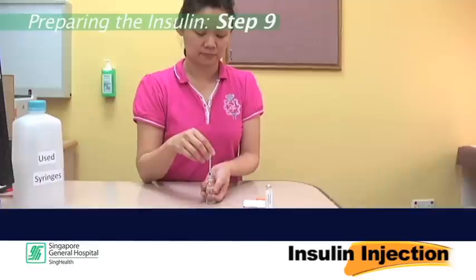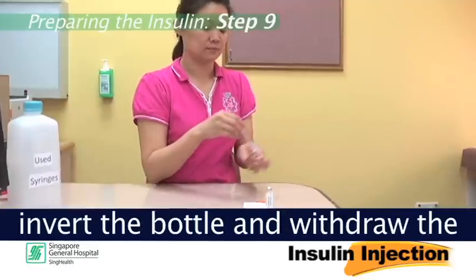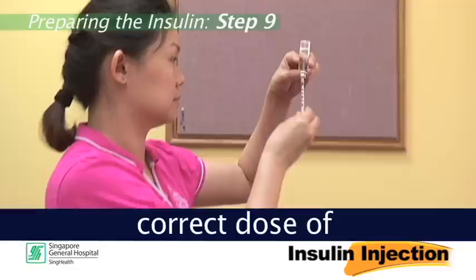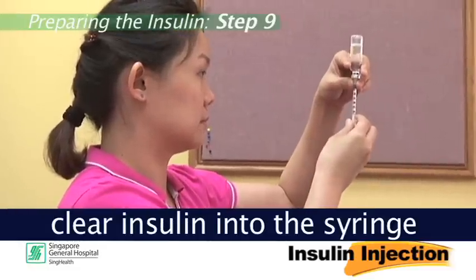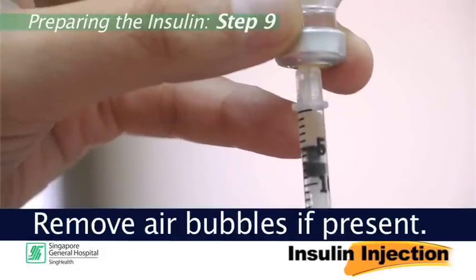Step 9: This time, with the needle in the bottle, invert the bottle and withdraw the correct dose of clear insulin into the syringe at your eye level. Remove air bubbles if present.